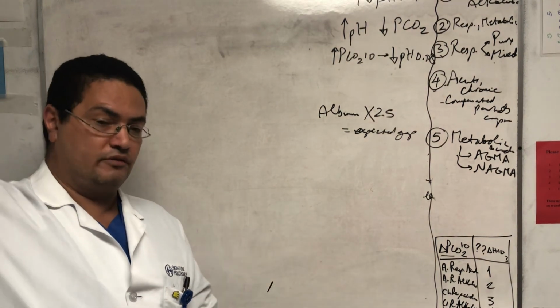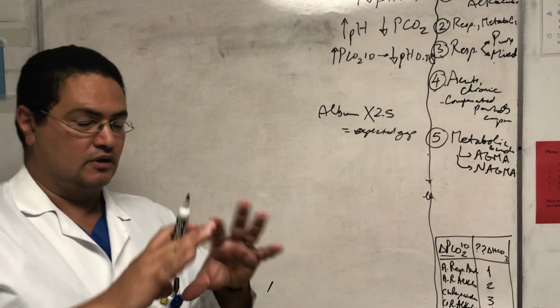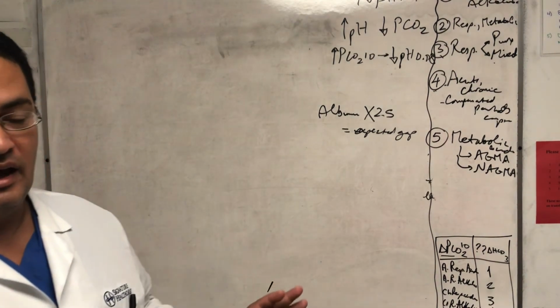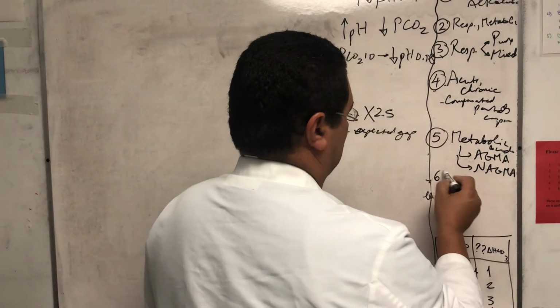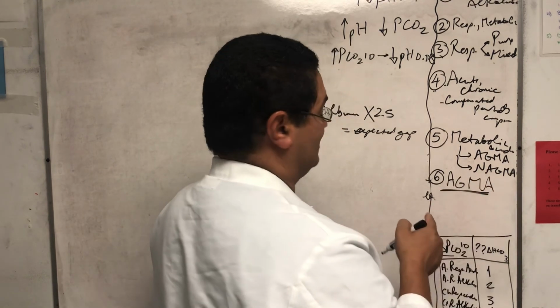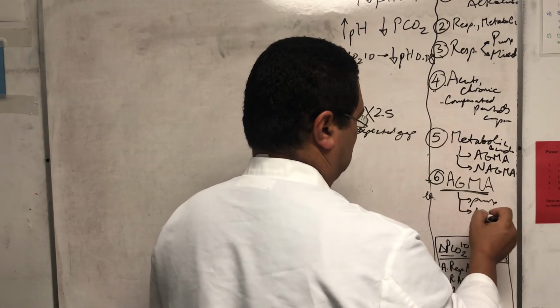If you decide to do it with the formula and stabilize the expected gap at 12 and change the measured gap based on the albumin, you're going to go through the formula, brackets and all of these things, and then come up at the end with the same result, right? But it's easy to remember it this way. Right, next is if it's anion gap metabolic acidosis, and only if it's that. I see people do it for alkalosis, there's no need to. Pure or mixed.